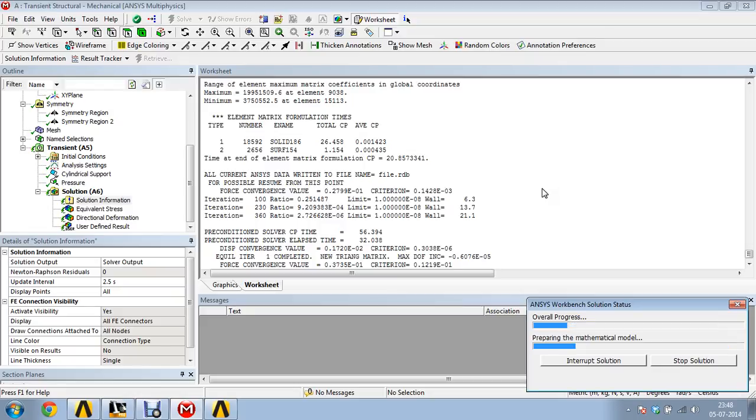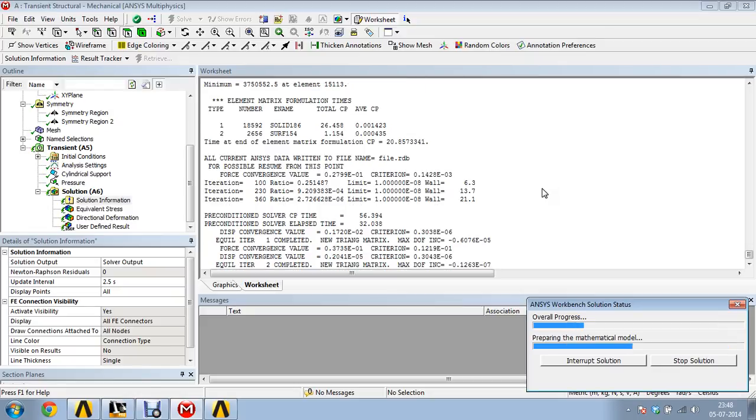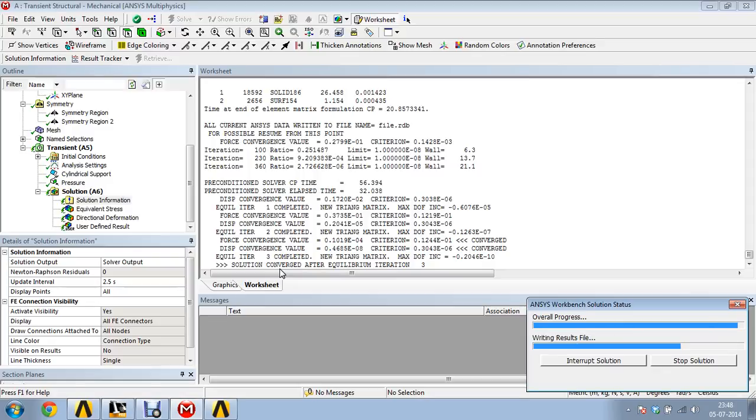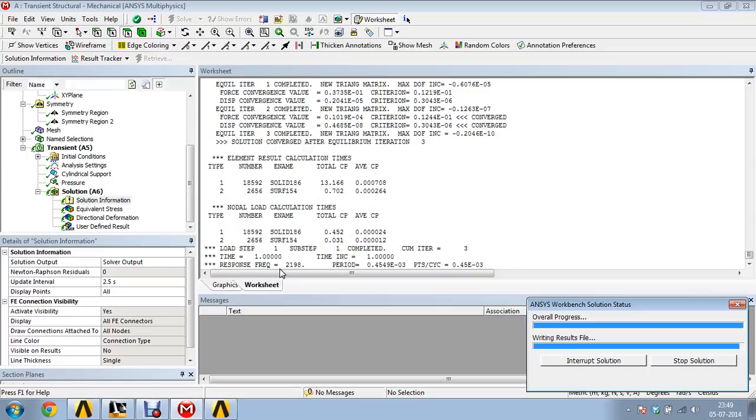You can see that force convergence is reaching near the criterion, and you can also see that displacement convergence is also reaching the criterion. Because of proper symmetric conditions and boundary conditions, there is no problem for it to reach the convergence value within a few iterations. Okay, so in the second iteration it has reached the convergence value. Force, okay. I think in this iteration displacement convergence will be reached, so let us see. Yeah, both force convergence as well as displacement convergence have been reached and now the solution is over. So let us see what happens.